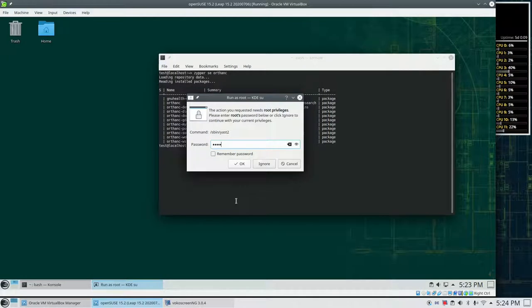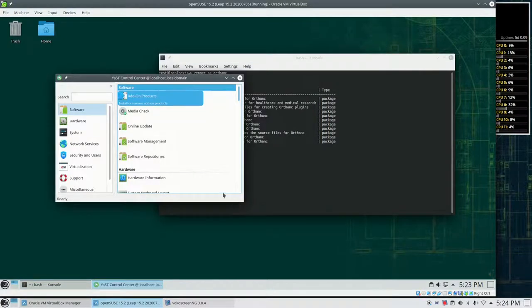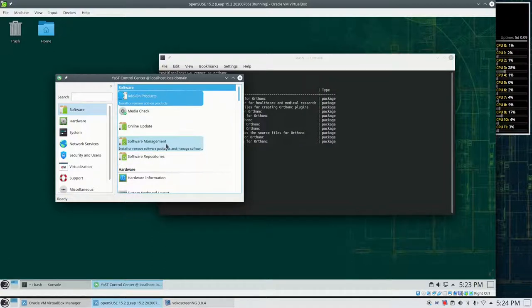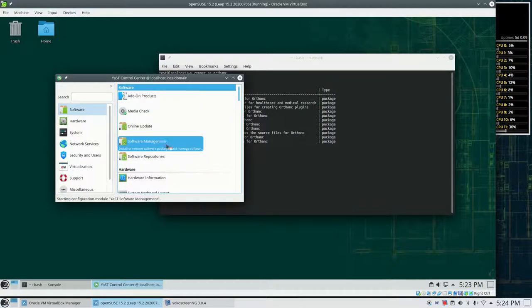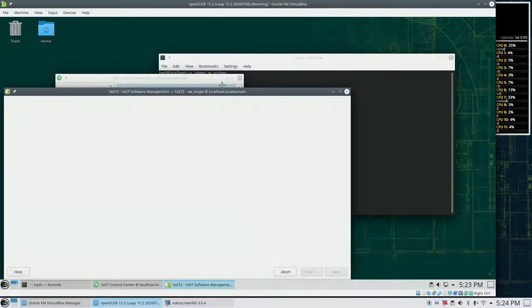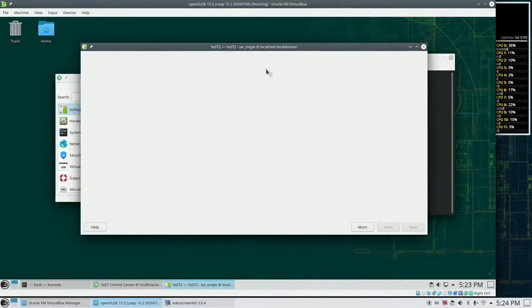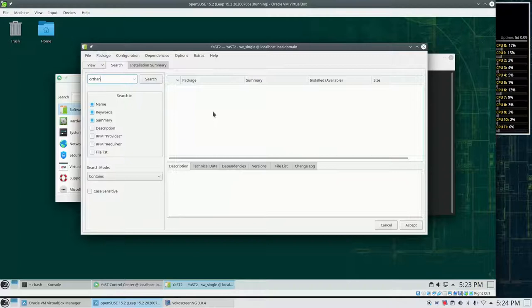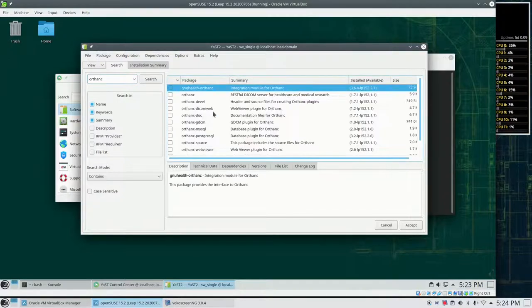We need the admin password here as well and we can go to software management. Fire it up, and here as well we can search for Orthanc.